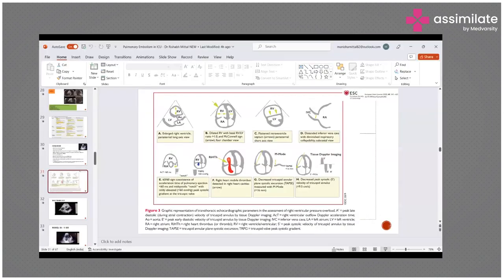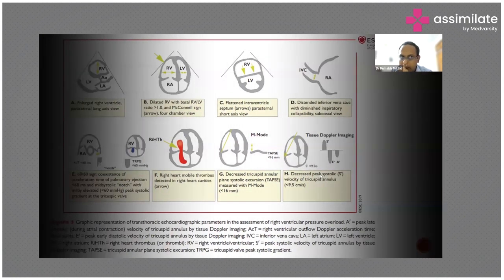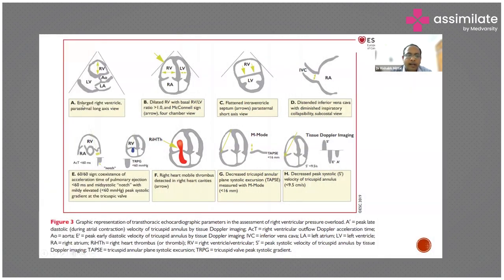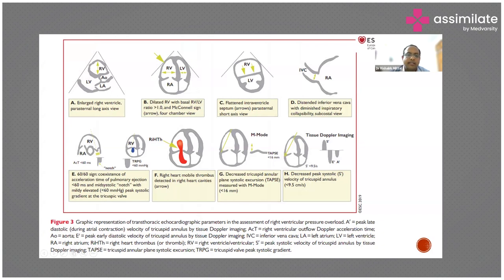This is a diagrammatic representation — in the parasternal long axis view we can see an enlarged right ventricle; in the four-chamber view we can see McConnell's sign; in the parasternal short axis view we can see the D sign or RV dilation. RV size equal to or greater than LV suggests pulmonary embolism. There may also be IVC dilation and sometimes a clot inside the right ventricle and right atrium.